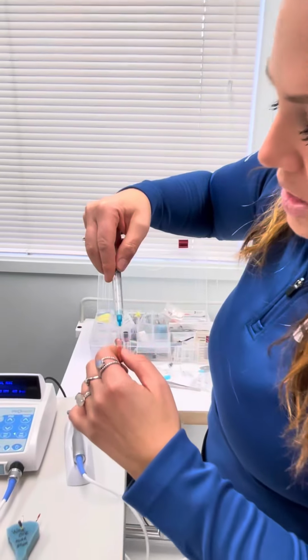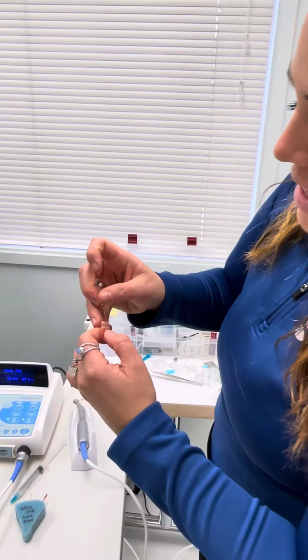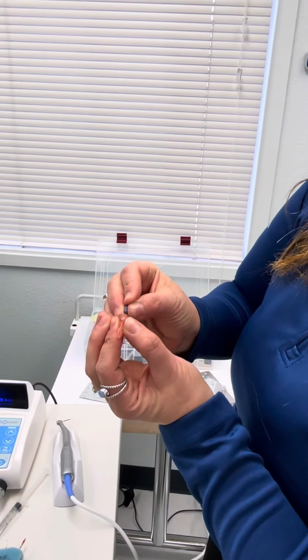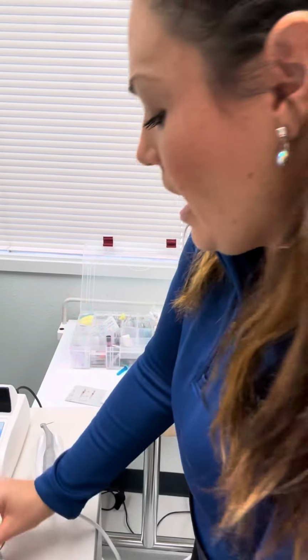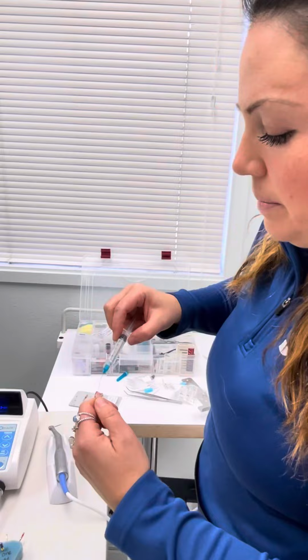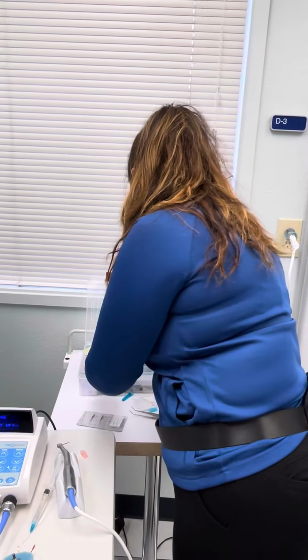Then they're going to irrigate, recapitulate, meaning just making sure that we're not stuffing any debris past the apex. And then they're going to go irrigate again. Ideally, endoactivate at this point. So go ahead and do that for the sake of it.